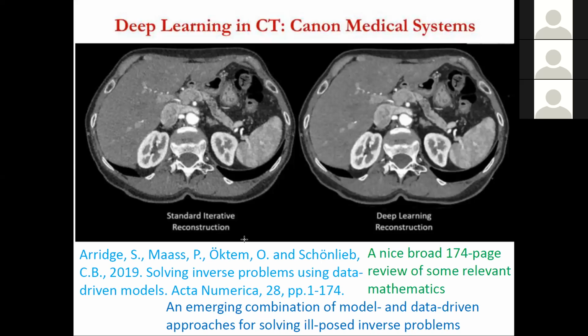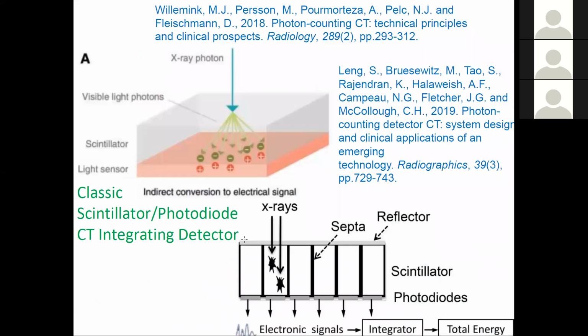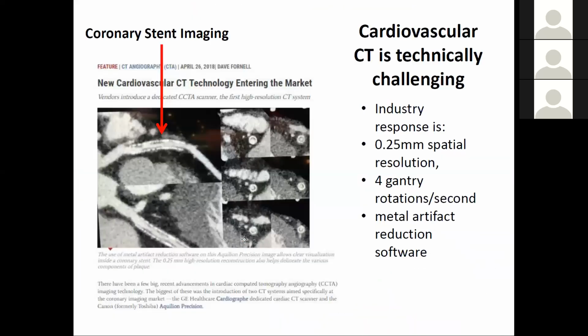So in our cardiac CT studies, not for every animal we were scanning, but for some of them, we were observing those streak artifacts. And a colleague of ours was referring to them as metal artifacts, as you were also doing. So another colleague and I started discussing where they would come from, since we wouldn't know where there would be any metal. But what I understood now is that metal artifact doesn't necessarily mean that there's actually metal in the subject. Is this correct?